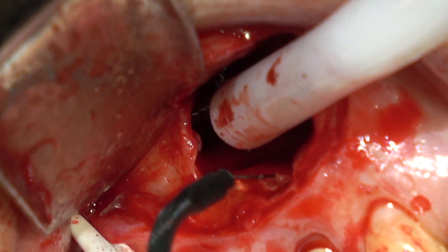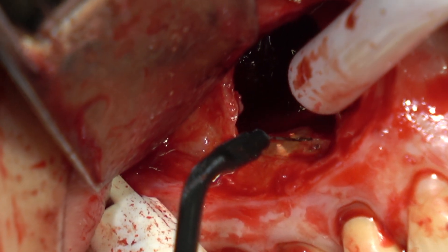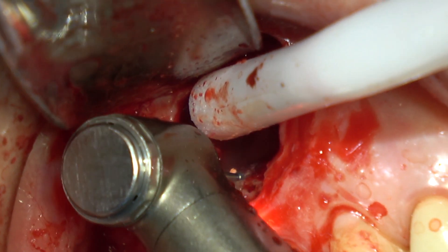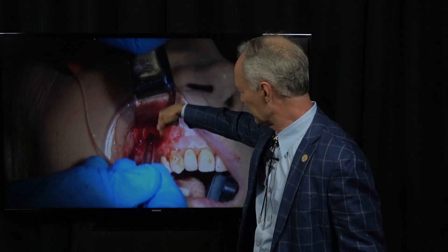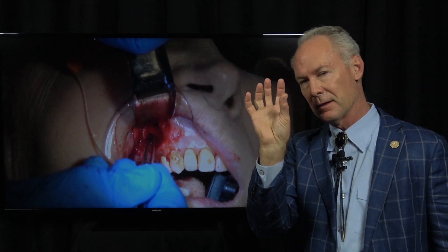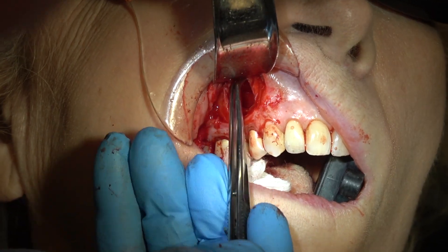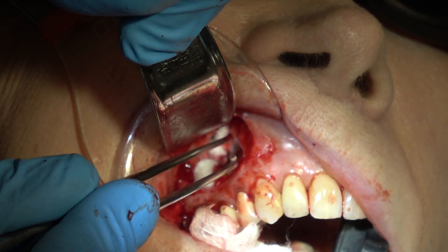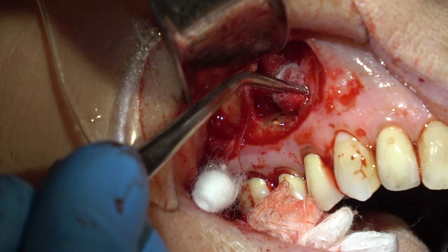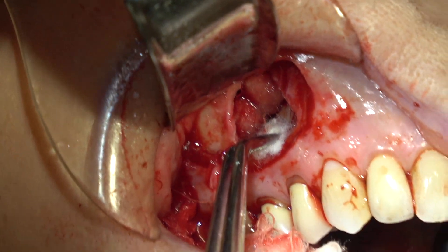Now I'm using a radiosurge to touch some of the bleeding areas and just help stop the bleeding so I can retrofill the apical parts of the roots of the teeth. Probably the most difficult part of this procedure is stopping the bleeding. You've got the bone bleeding and the soft tissue bleeding.